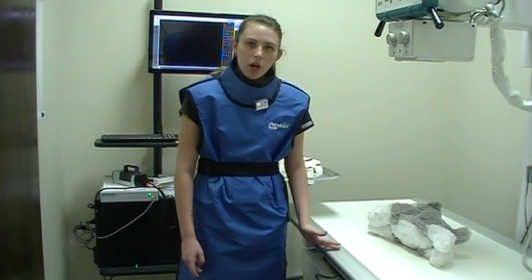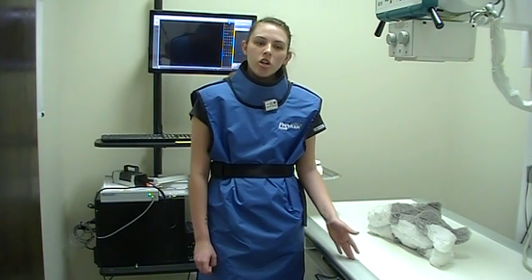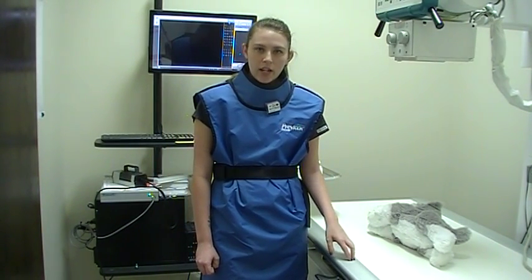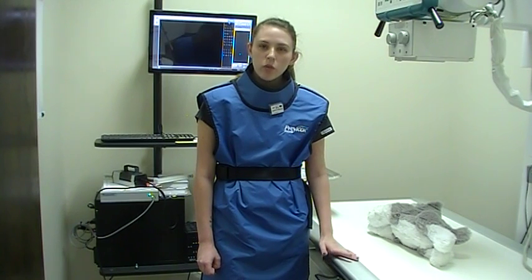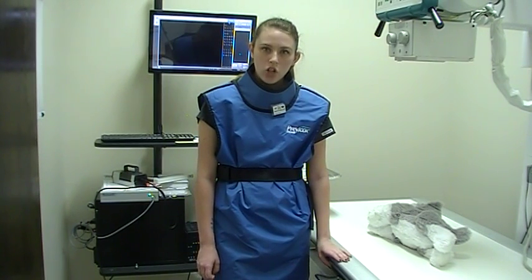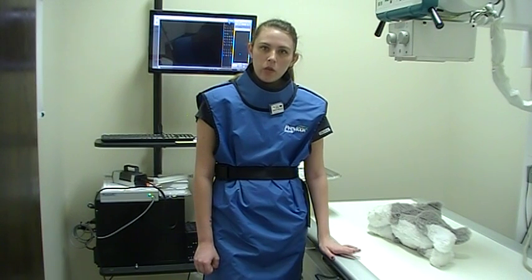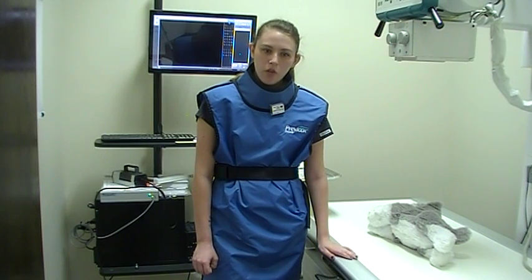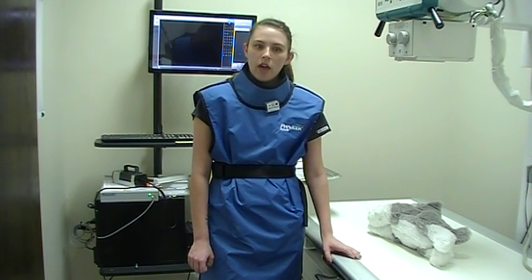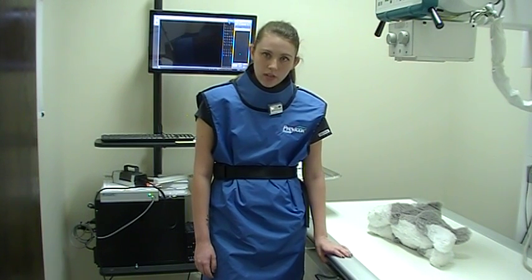First I'm going to talk about what a contrast study is. A contrast study is a series of radiographs taken at specific time intervals with the administration of a contrast media. For today's study I'm going to be using barium sulfate, which is a positive contrast agent that appears white or radiopaque on radiographs.